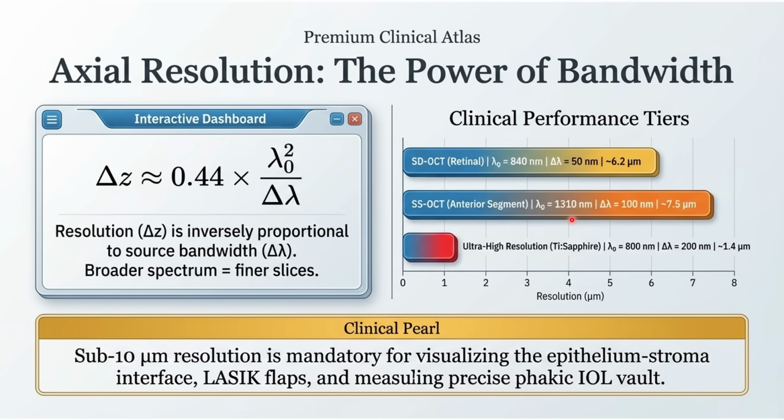That's why we should say that there is no ideal OCT that has very high resolution and very high penetration for all structures of the eye. This is theoretically possible, but practically it is not there. So we have to determine and choose the OCT based on your need, in what specialty or what structure you are going to use it.